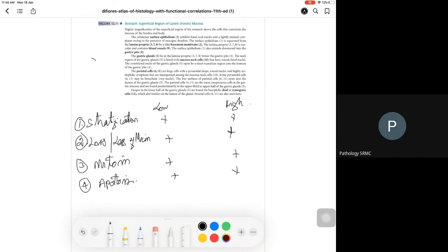For example, this is a gland. Normally single layer, but this is tumor, so it is multi-layer. So there is stratification. If the stratification and if the nuclei are seen touching the top of the epithelium, then it is high grade dysplasia. Whereas in low grade dysplasia, there will be some cellular proliferation, but the nuclei may not be seen in the upper 1/3 of the epithelium, stratified epithelium.